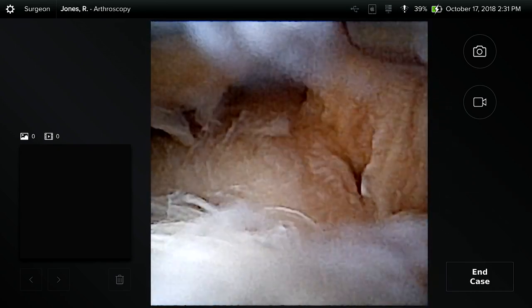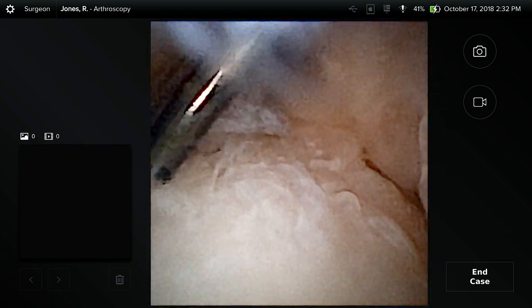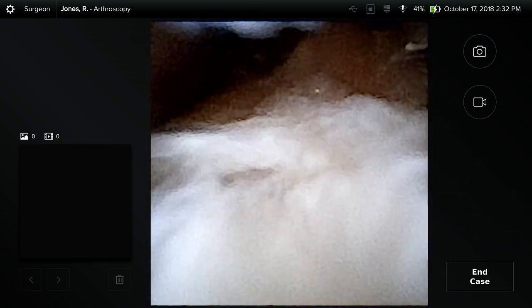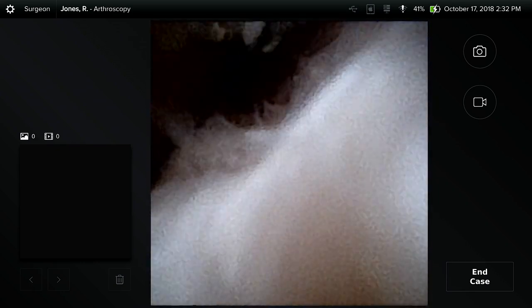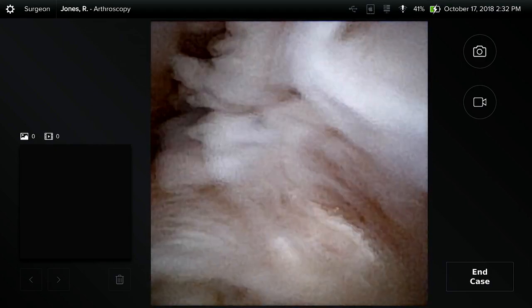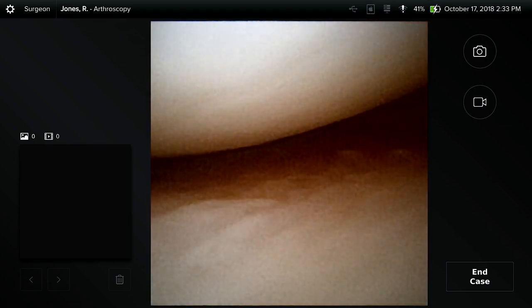Here we can check our ACL — probing the fibers of the ACL with the probe. Lifting up on those fibers, and if we want to drive into the posterolateral portion of the knee — with a zero degree scope from the lateral portal I'm now looking in the posterolateral aspect of the knee, retracting those ACL fibers. There we are at the root of the lateral meniscus. There's our medial compartment of the knee joint.